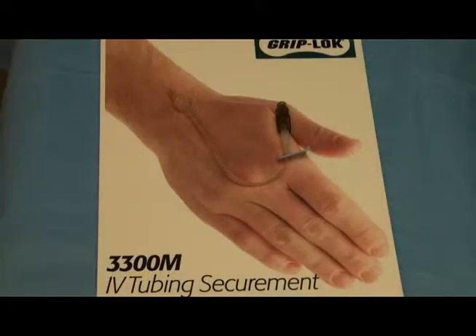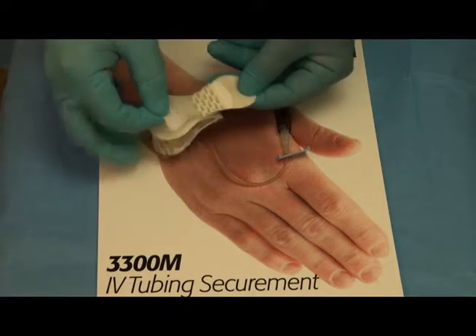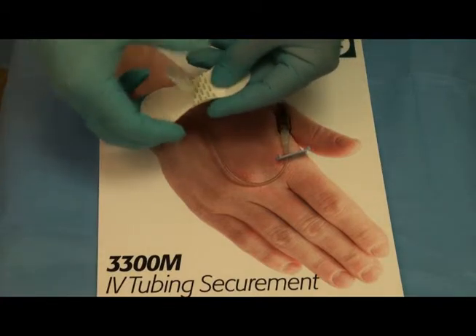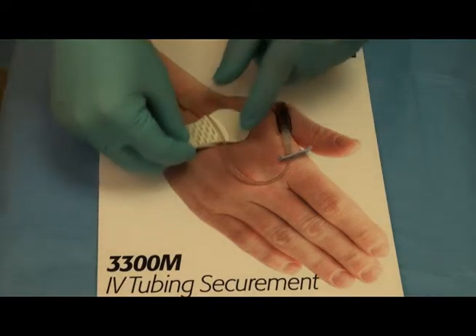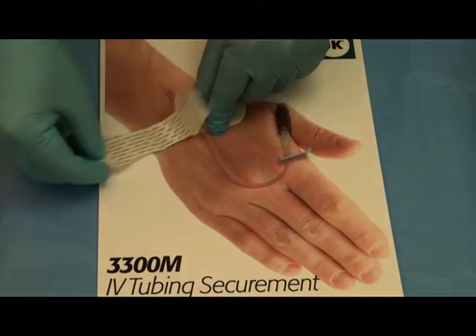Open the top velcro fabric cover of the Grip Lock. While holding the velcro fabric cover open, slide the Grip Lock under the IV tubing so that the IV tubing is positioned in the center of the adhesive area.